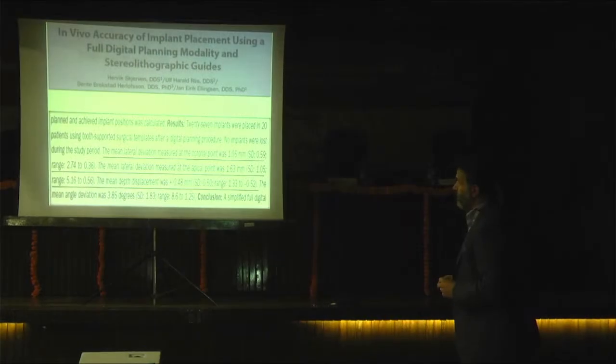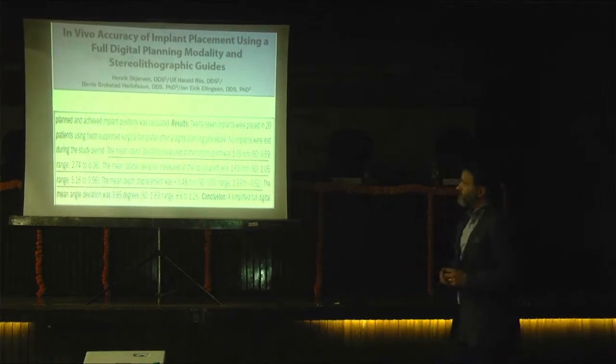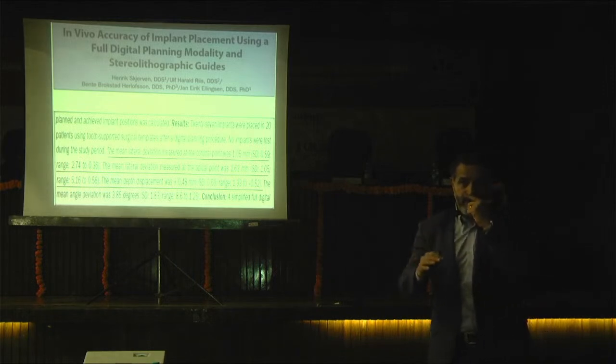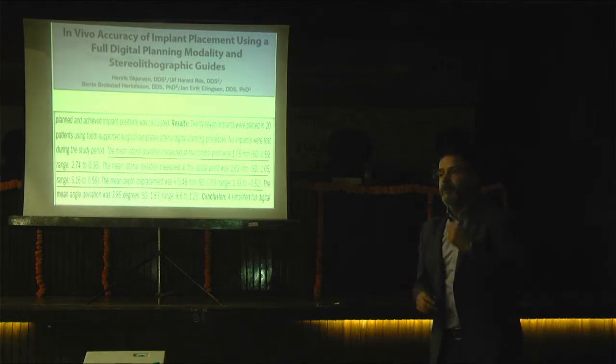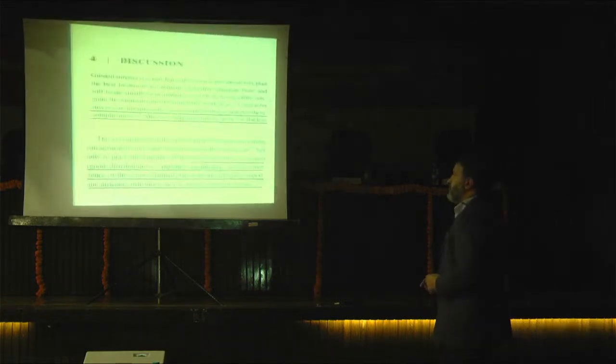And another scientific paper classifies the deviations at the coronal place, the mid place, and the tip of the implant, and it's around 1.6 millimeters.